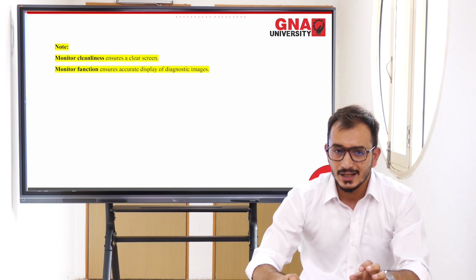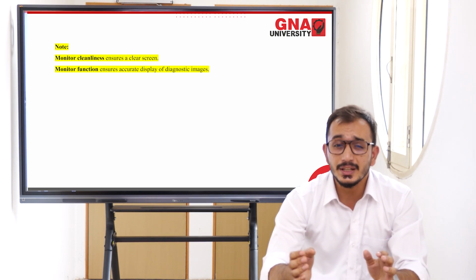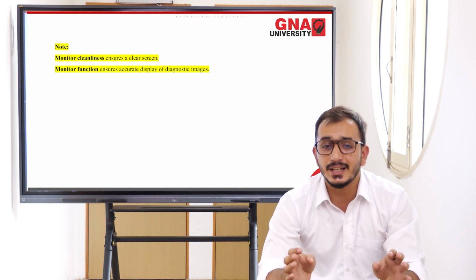And the next thing is monitor cleanness, which ensures a clean screen. And what is monitor cleanness? Simply, it ensures a clean screen. And the monitor function ensures accurate display of diagnostic images. It ensures that all the diagnostic images appear on the display with high quality and accuracy, so that our diagnosis can be good and accurate.